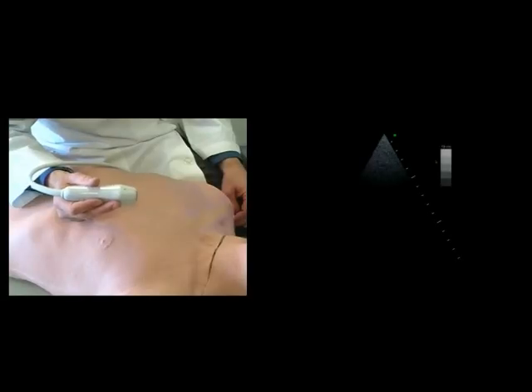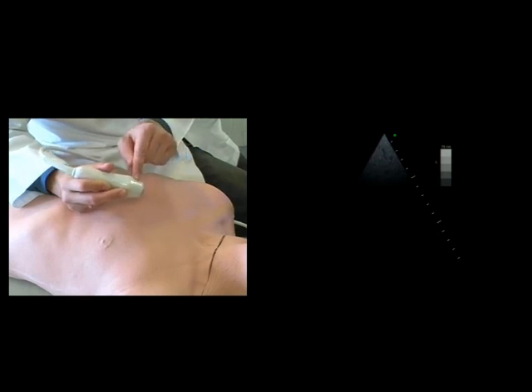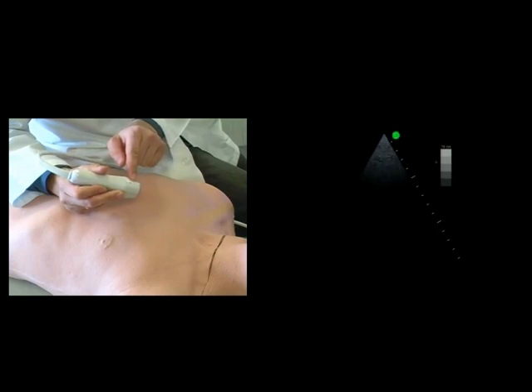This simulator consists of a probe and dummy, a 1 to 5 megahertz phased array cardiac probe. A small bump on the side of the probe marks the so-called index mark of the probe. This corresponds to the small marker on the top right-hand side of the screen.